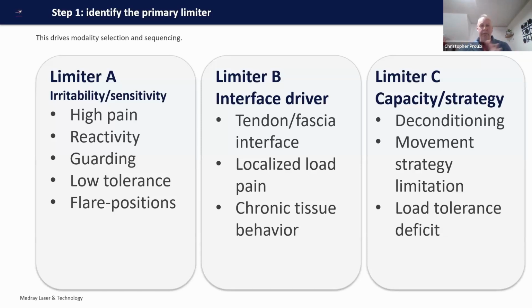Then the interface driver. So we looked at, what is their pain? What does their response look like to the delivery of something? And then what are the problems that we're dealing with? And so we're looking at tendon, fascia. Do they have localized pain or discomfort on load? So I just said, when someone is standing versus lying down, what are the mechanisms associated with that? And potentially what is their problem?